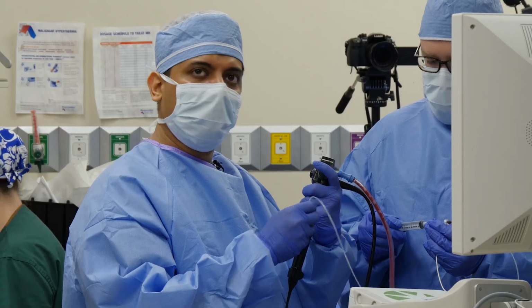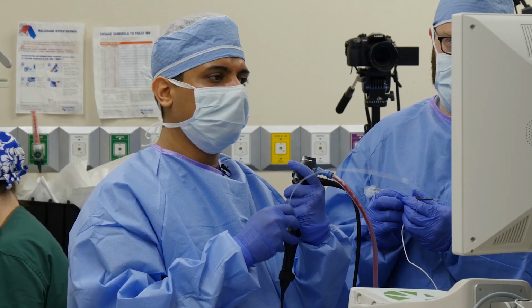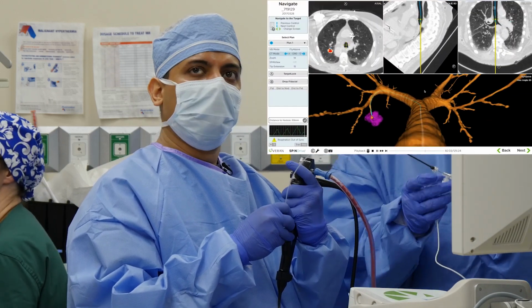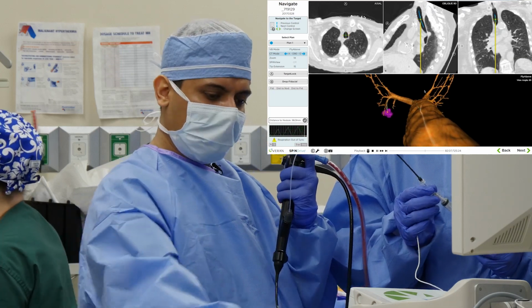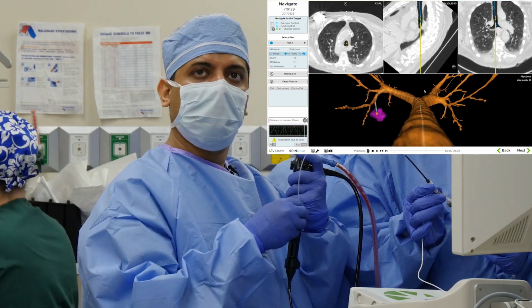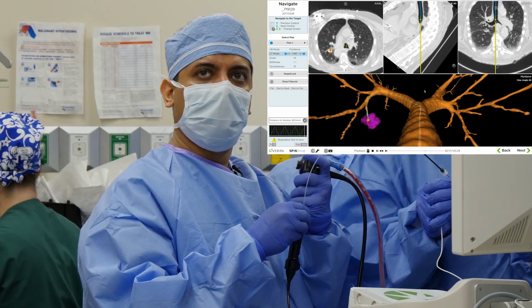You kind of have to put the needle into the scope and get it to the tip before I navigate, because when I'm making acute curves like that, it's very difficult to make the needle bend through a curved scope. The needle is in, but it has blurred my camera a little, but that's good. So we'll get it right to the edge.